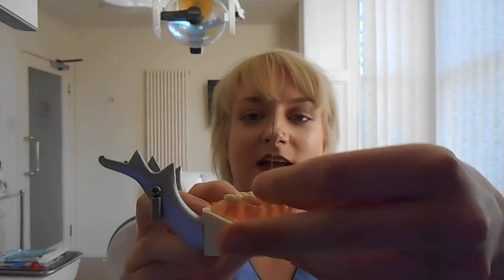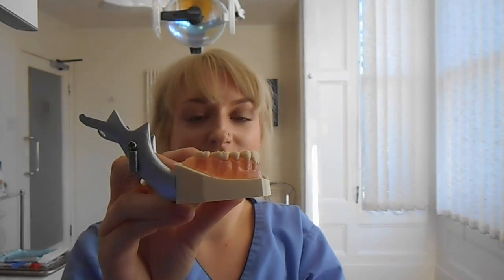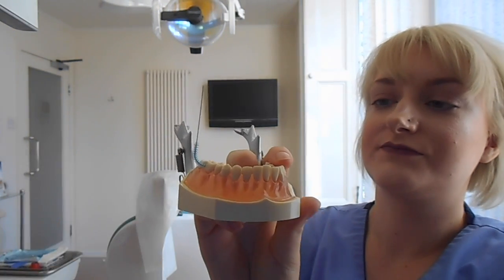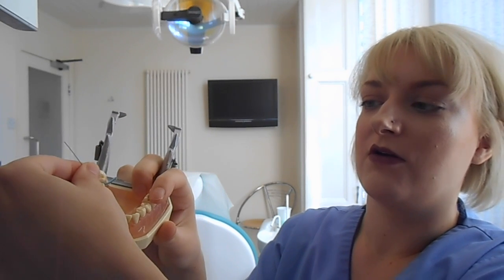So I want to show you on the model first, and then I'm going to demonstrate in my mouth because it's probably a bit easier that way. So on the model, you would go inside your mouth with your index finger, moving your cheek out of the way, and these three fingers would be on the outside of your cheek. Pop the brush in between your two teeth like this, and you are pushing the brush through. Now this brush is too small, but I'm just trying to show you. Push the brush through all the way like this, okay? And to get it out, you're grasping the brush, pushing down, down, down, down, and it will come out like that.